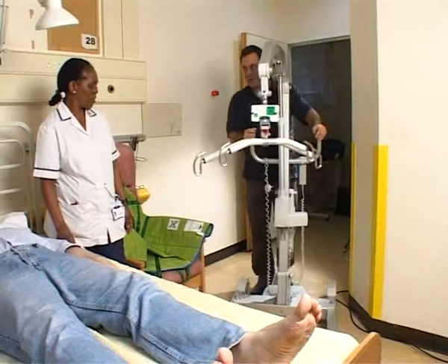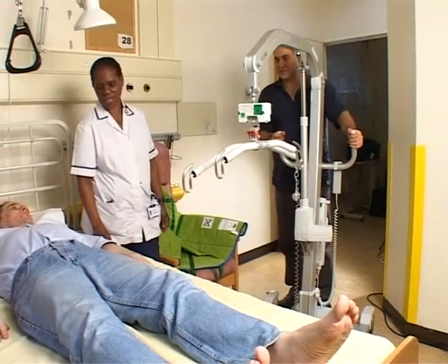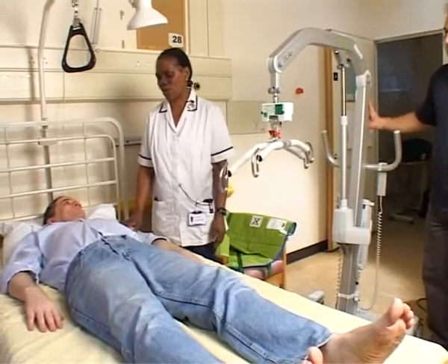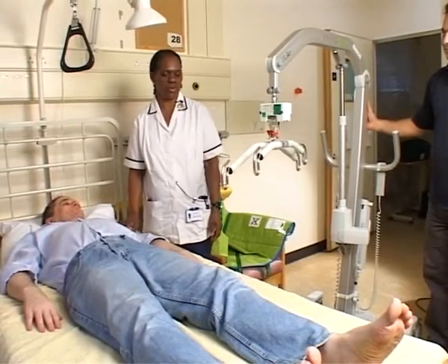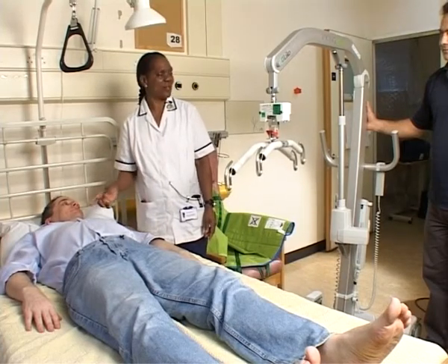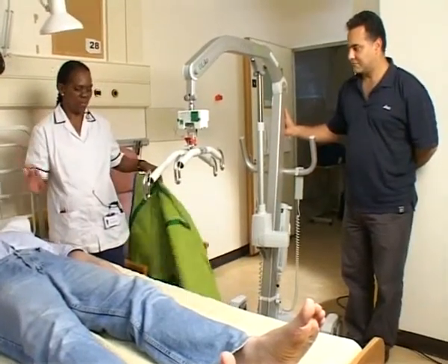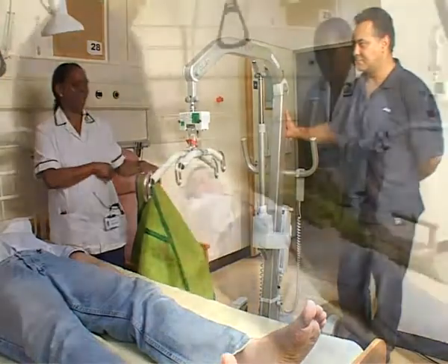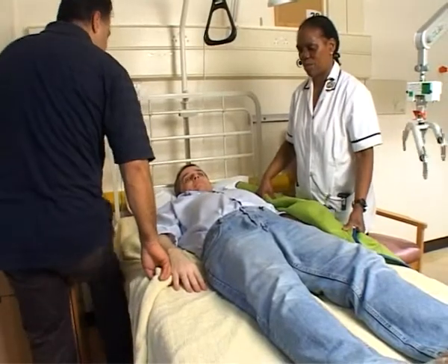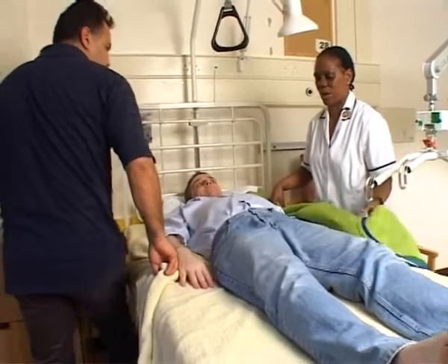Mylex, can you show me how you transfer a patient from the bed to the chair, and back from the chair to the bed again? Eddie here is somebody who hasn't been transferring on his own, so we're not sure how he's going to transfer using his leg. So we're going to use a hoist, and I'm going to need a hand on the other side to roll him and put the sling under him, and then transfer him from the bed to the chair. Pop the bed up so that you don't have to lean over on top of Ed — pump the bed up so that both you and I don't have to have back problems.